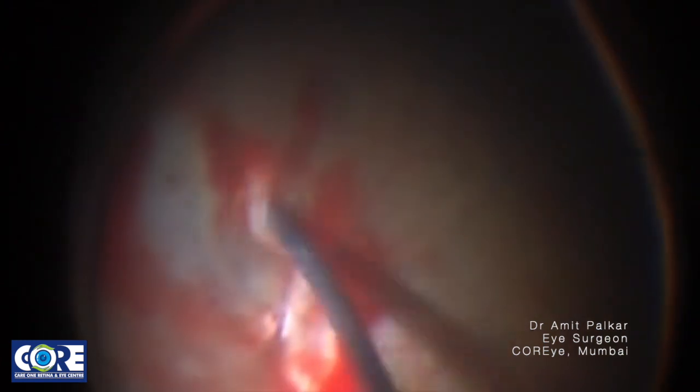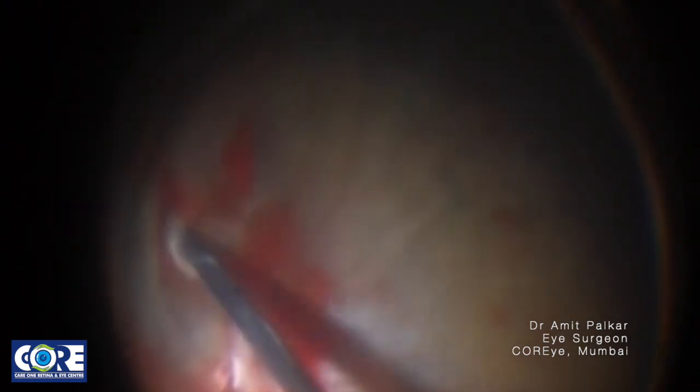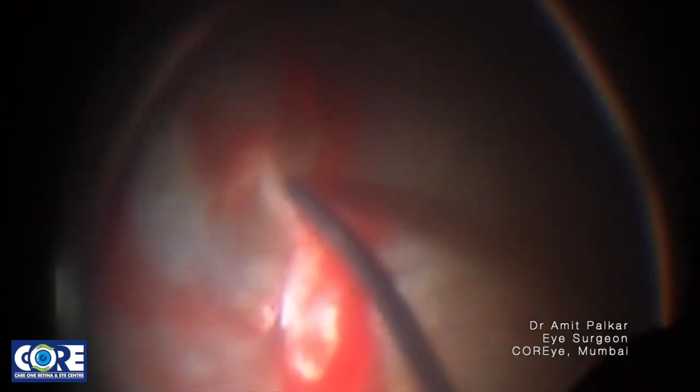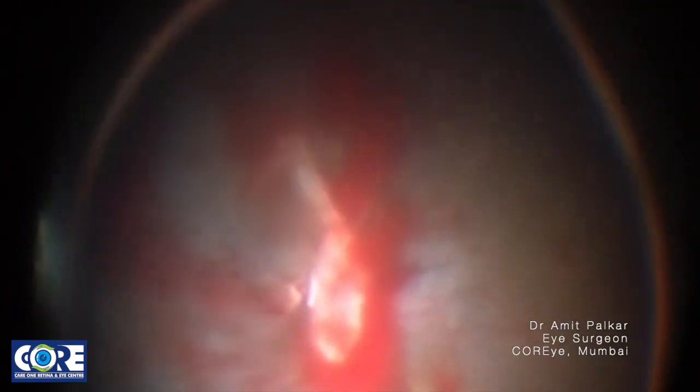When such adherent membranes are dealt with, there is usually a large neovascular front in it.